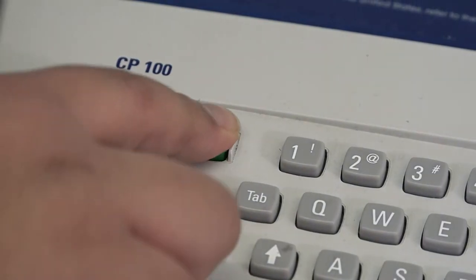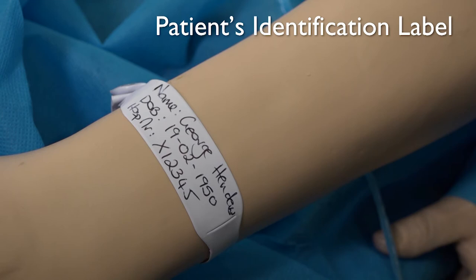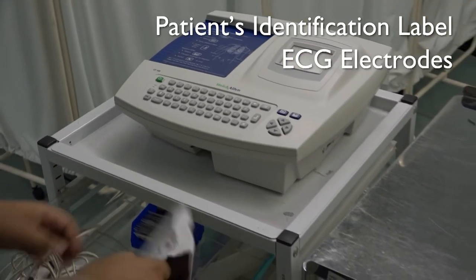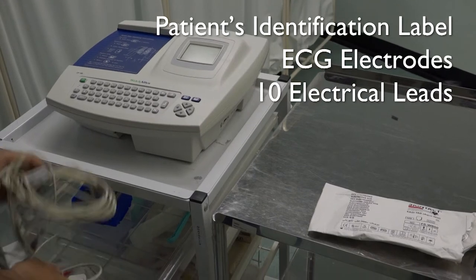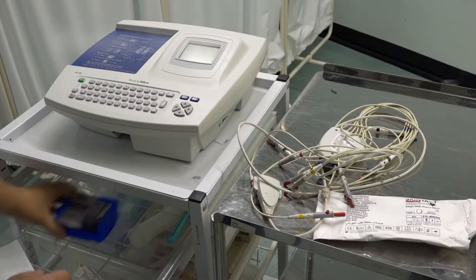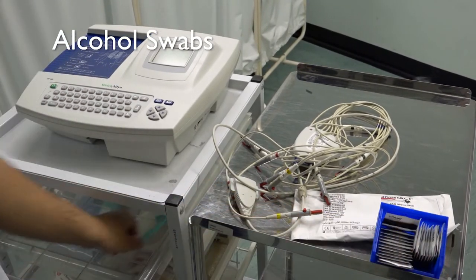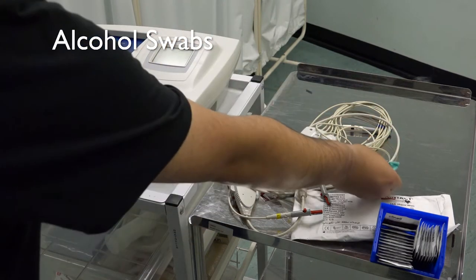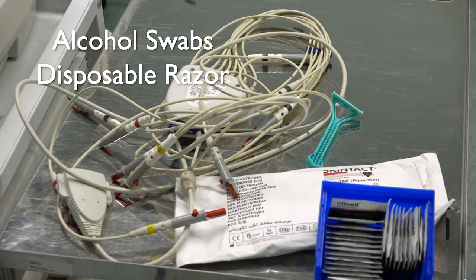Check the machine is working and that you have all of the equipment. You will need the patient's identification label, ECG electrodes, 10 leads and ECG paper. You may also need alcohol swabs to clean the skin if the patient is perspiring, or a disposable razor if a lot of chest hair is present.